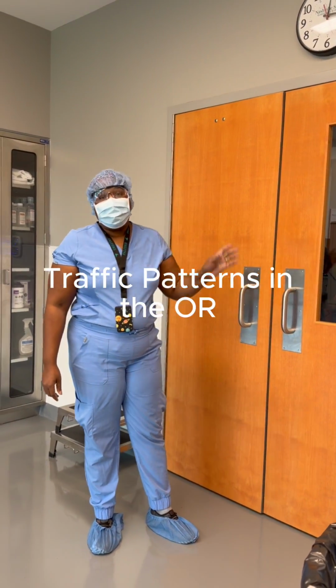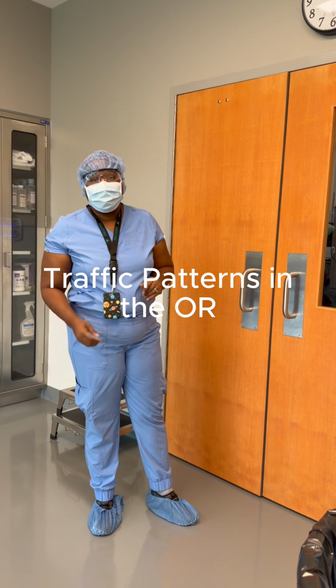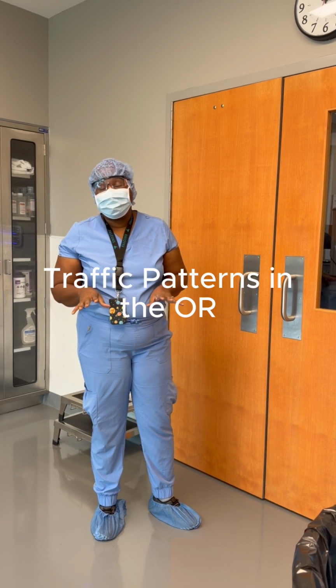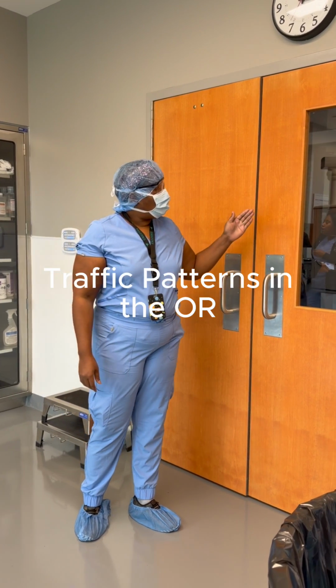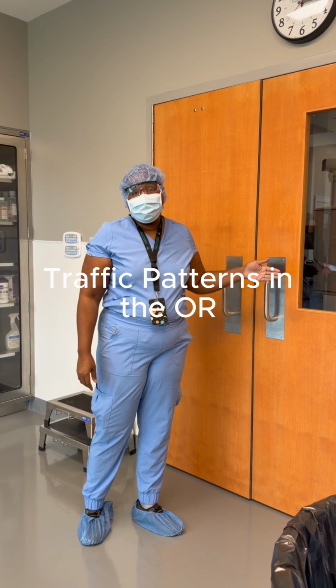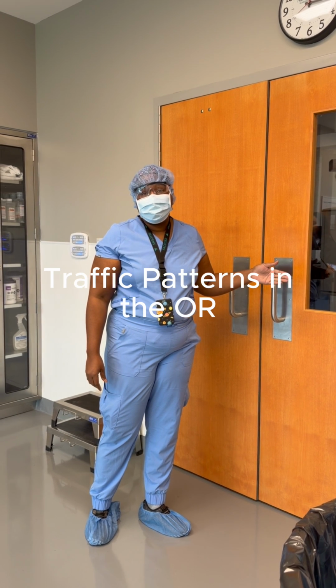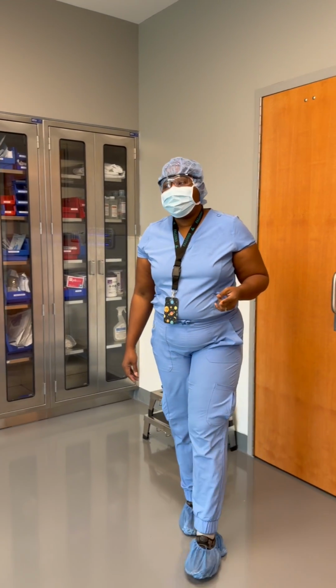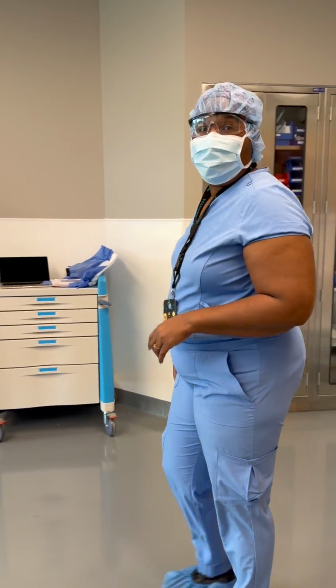All right. I'm Cassandra, I'm the circulator, and I'm going to explain the direction of the traffic pattern for the OR. Once you come beyond these double doors, you have to make sure you have your PPE on. Come through these double doors, then we're going to walk through the OR.